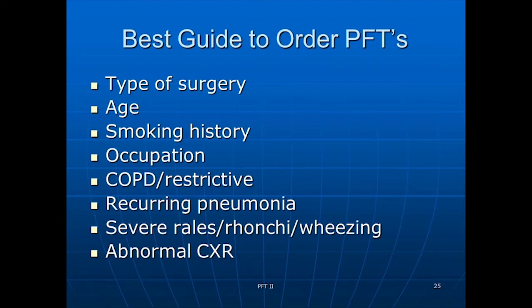But again, we look at restrictive, a problem with volumes, not flow. Obstructive, we have problems with flow, not volumes, is our general guide.